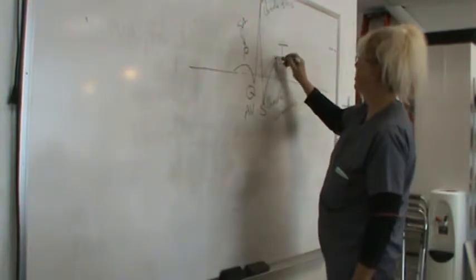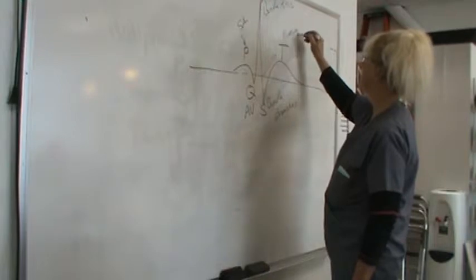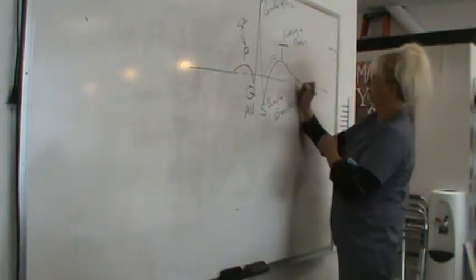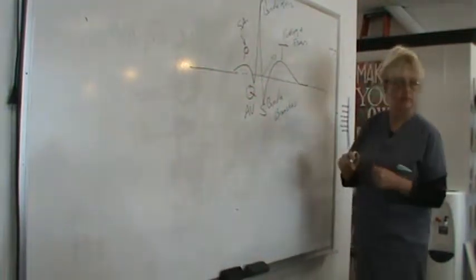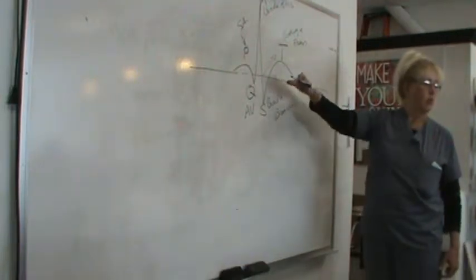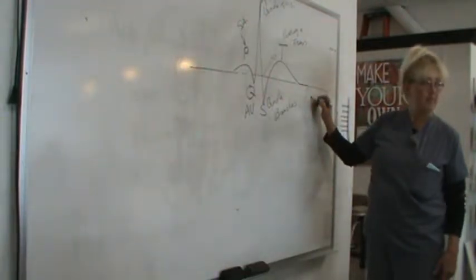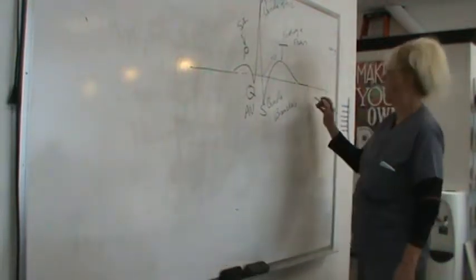And then going up through the T, we've got the Purkinje fibers. Now, let's look at what happens. This line right here is coming down, and it's flattening out, is it not? When it flattens out and becomes one with the horizontal or x-axis, we call this the isoelectric line. This horizontal axis that the rhythm is translated upon is called the isoelectric line.